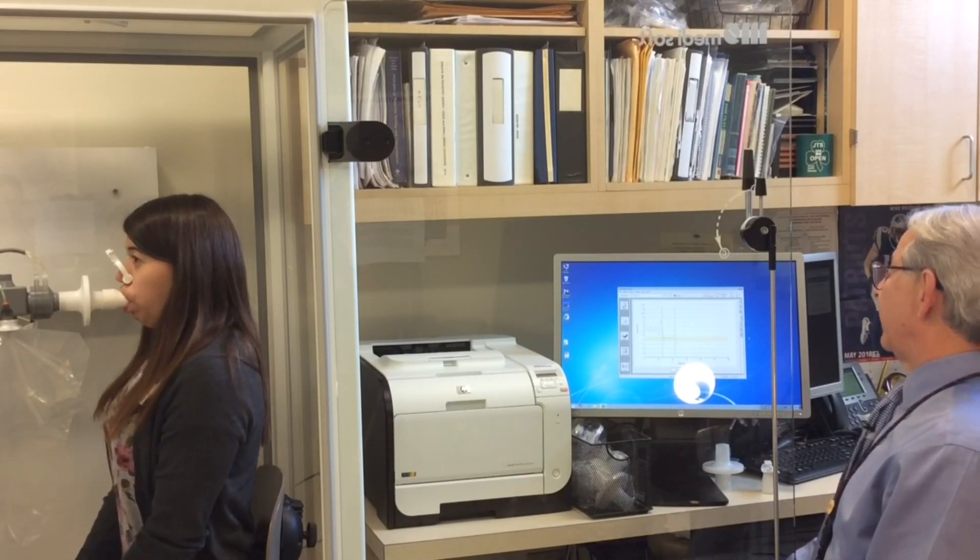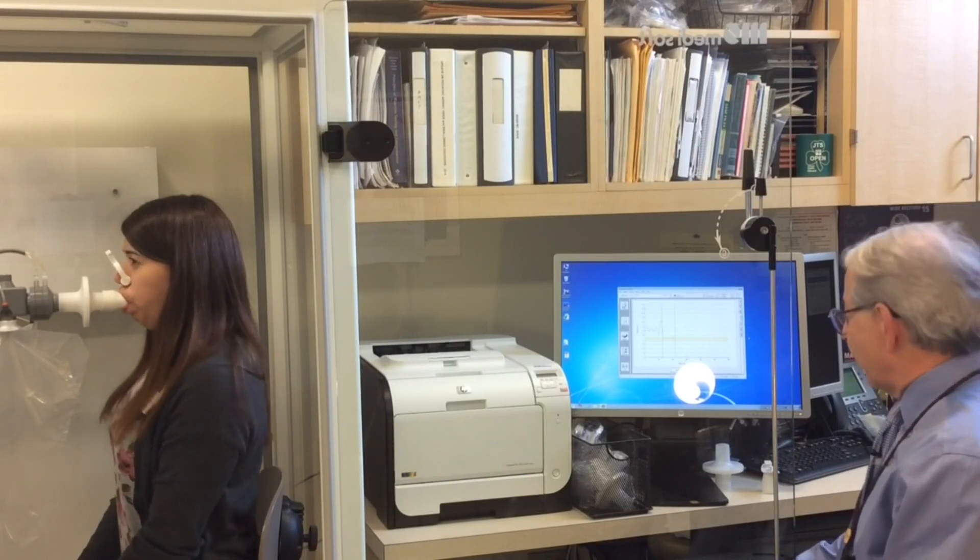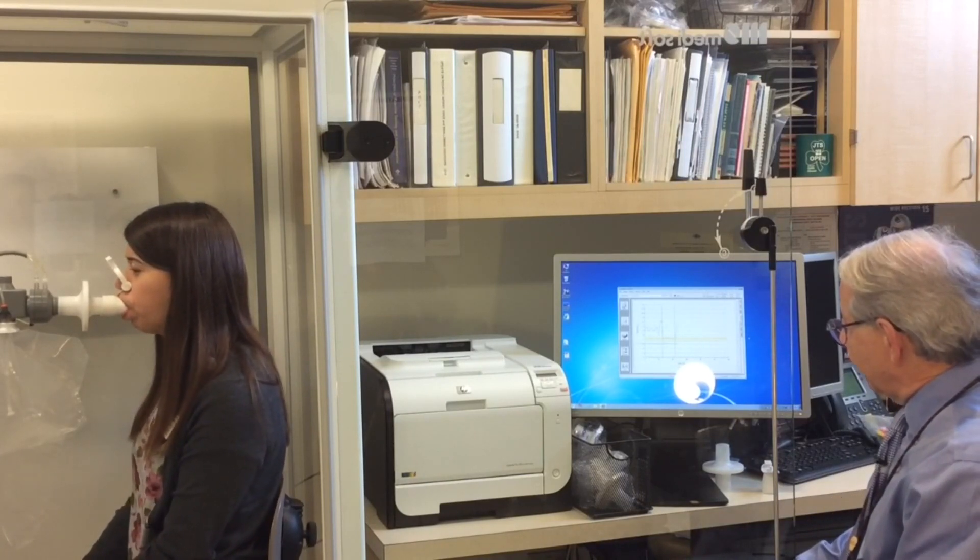Five, four, three, two, one, and blow it all out. Squeeze it all out. Nice job. Great.